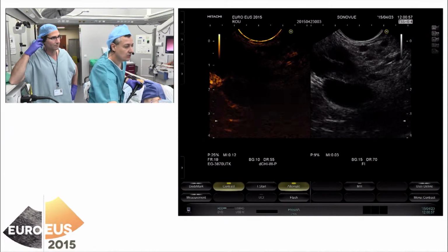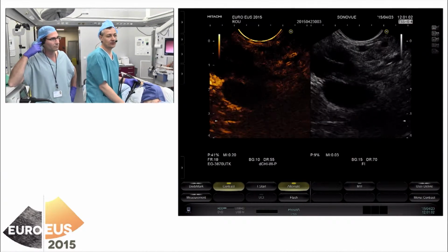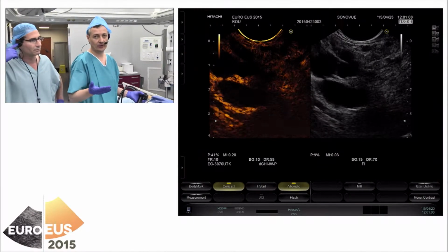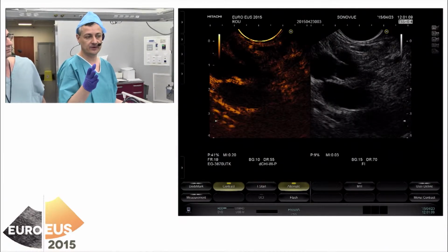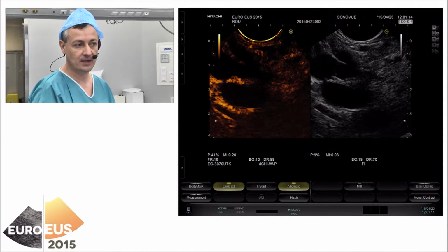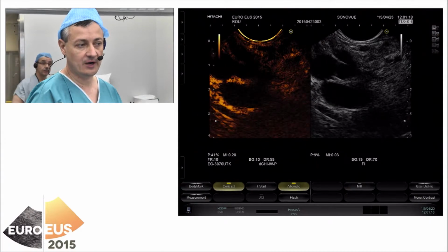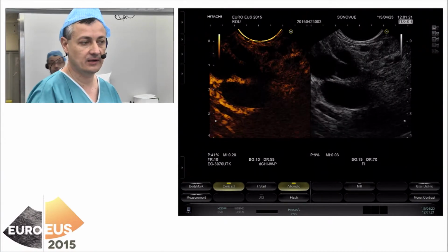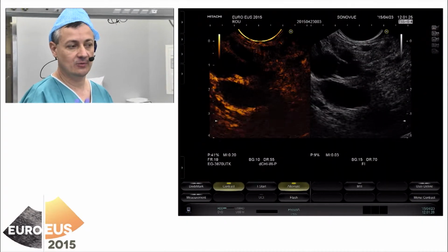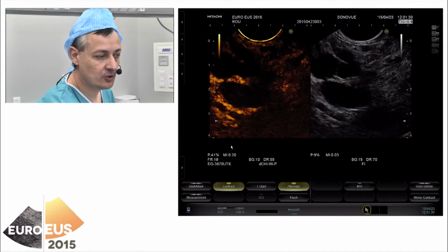So what we can do is increase the mechanical index. I usually prefer to increase it to 0.2. That's because we will probably look only at the arterial phase and the first part of the venous phase, so you only need 1 or 2 minutes for pancreatic examinations. So we don't care if we destroy some of the microbubbles using a slightly higher mechanical index. But if you want to get good images with nice contrast, then you have to go with the mechanical index to 0.2.